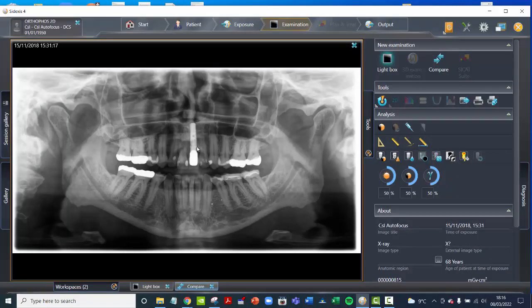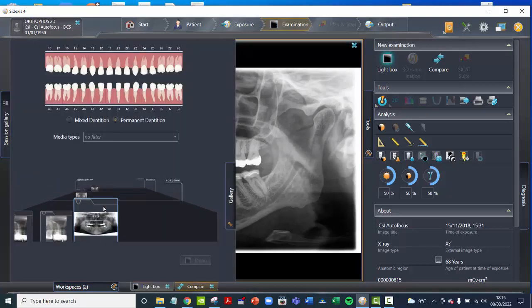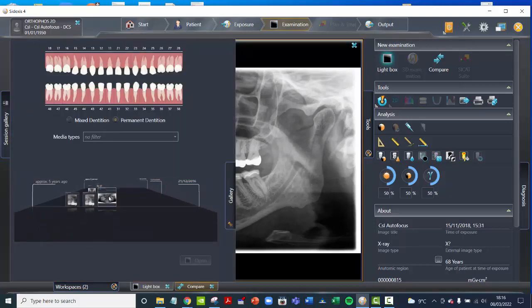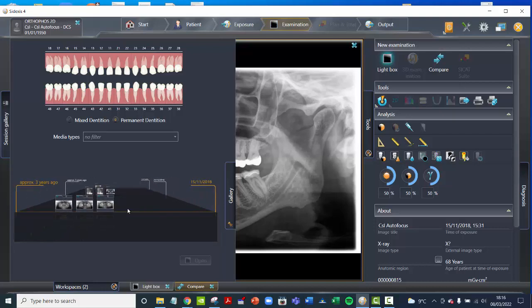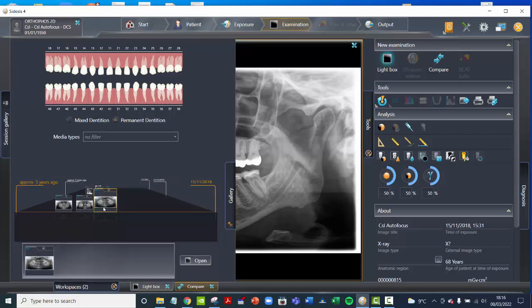Now we've got our first image here and we need to find a second image. Go down here to Gallery and then basically scroll backwards and forwards until you find the OPG that you want to compare to. Say it's this one — click on Open.